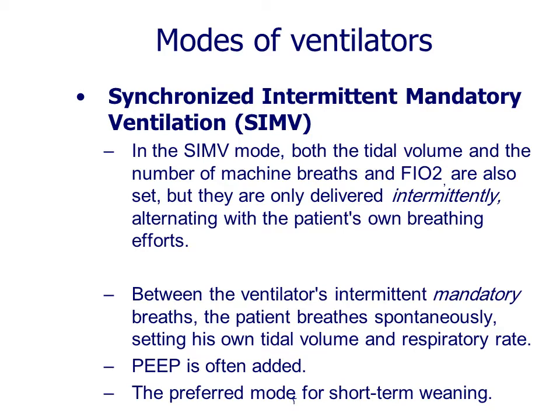Between the ventilator's intermittent mandatory breaths, the patient breathes spontaneously, setting his or her own tidal volume and respiratory rate. PEEP is often added and used for short-term weaning.